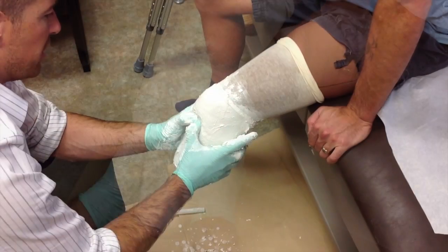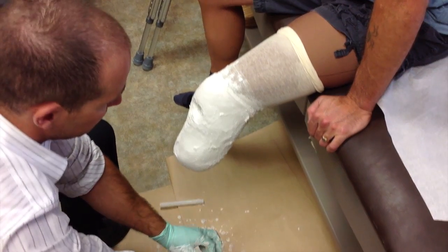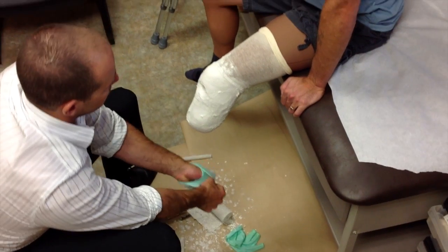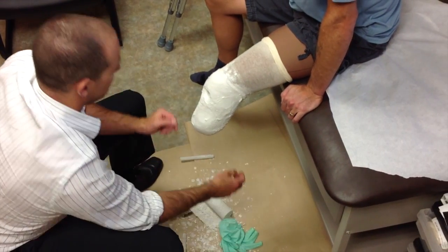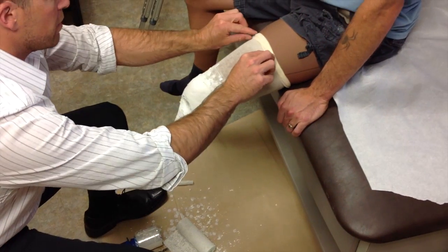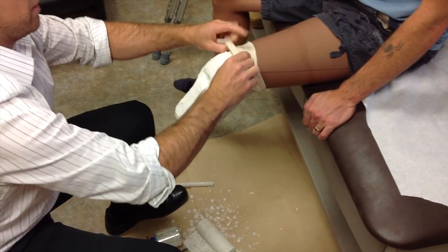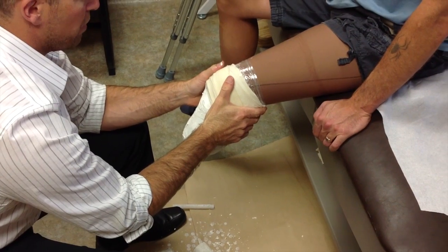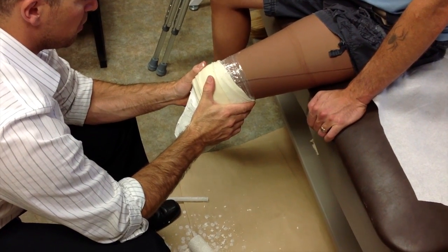After about five minutes, when the plaster has set off and hardened, it's time to remove the impression. The practitioner will pull down the stockinette layer and sort of free the impression from the limb. With gentle pressure, the practitioner will pull it from the limb.